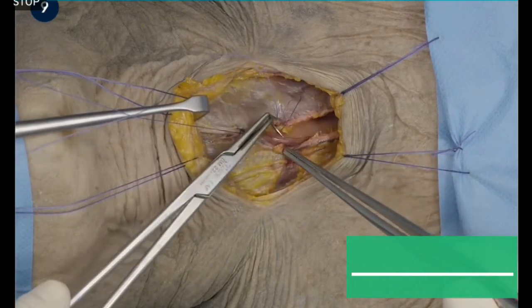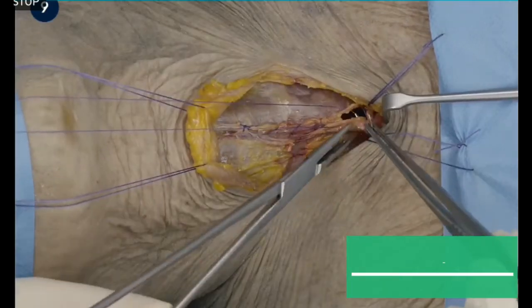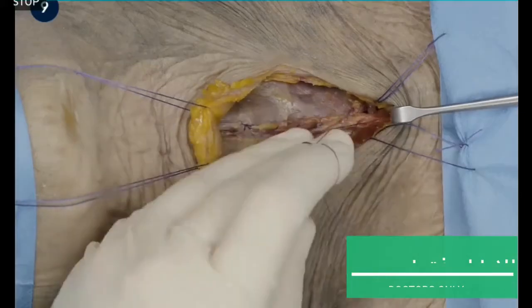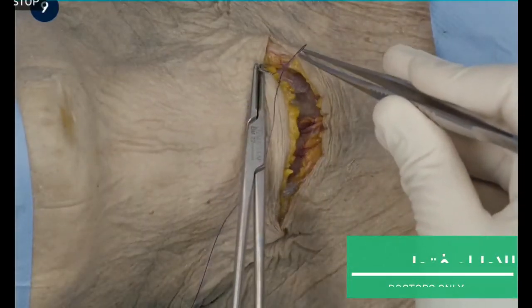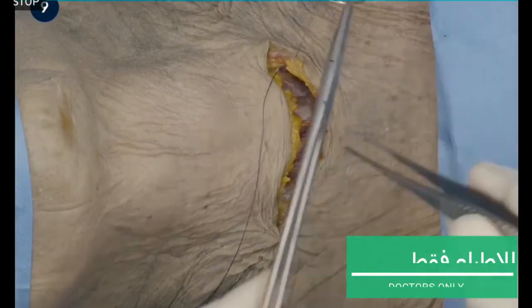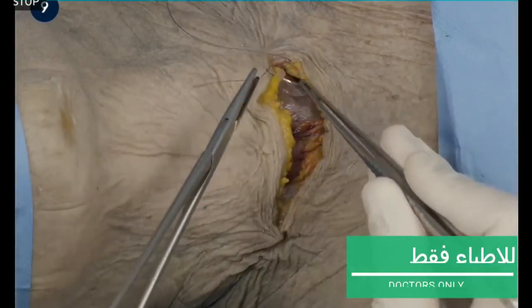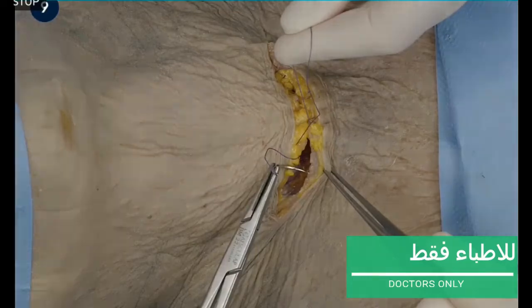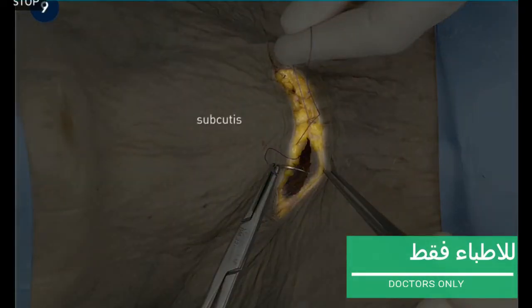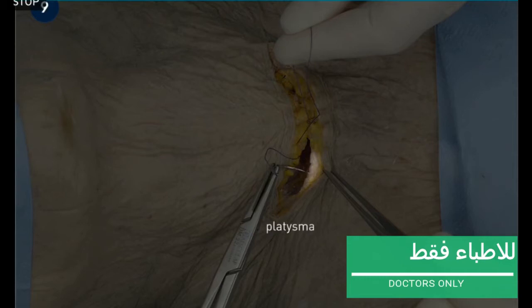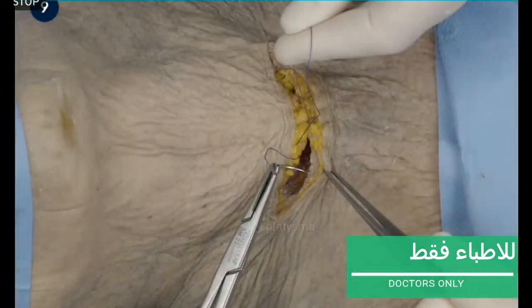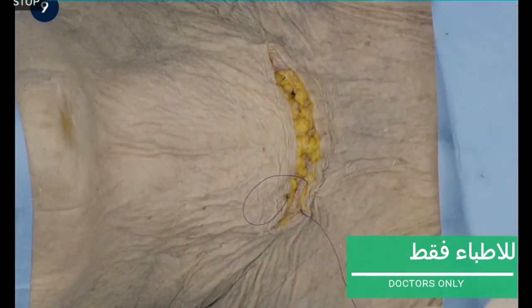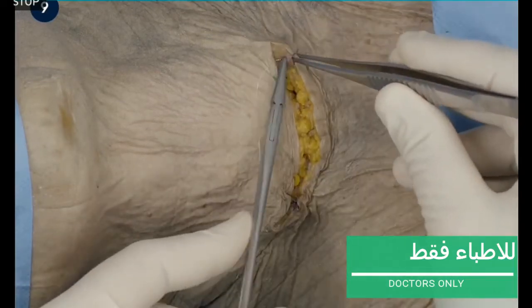The strap muscles are approximated with a running suture. Then the platysma is closed, followed by the subcutis. The final layer is the skin.